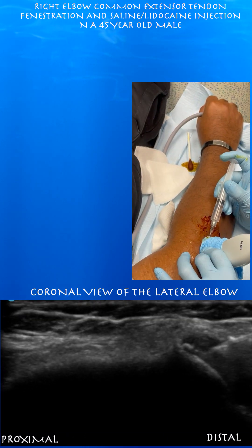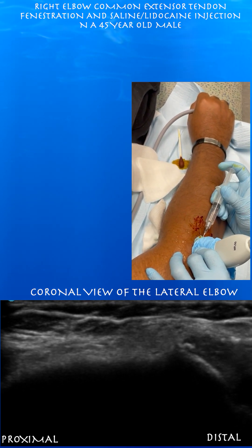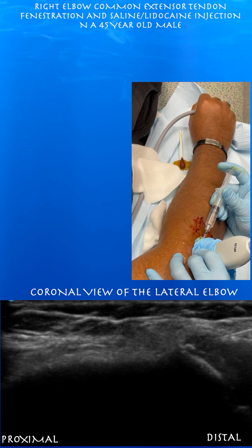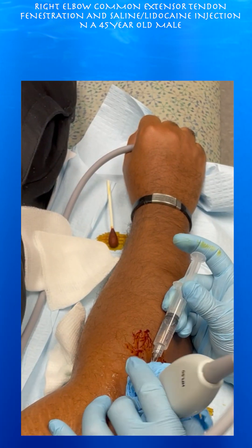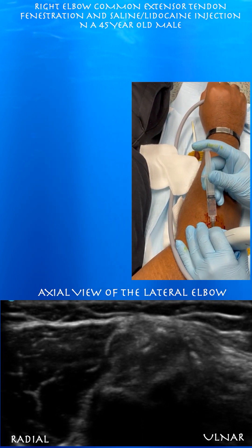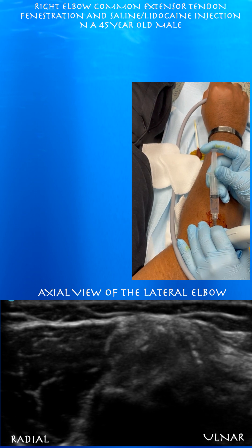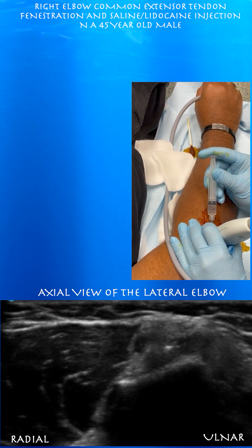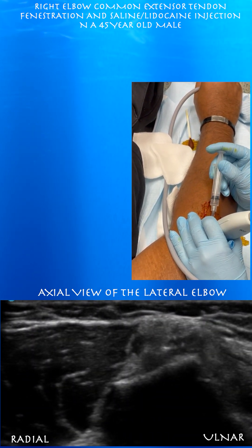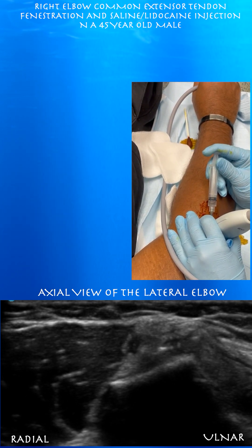Here you can see the needle on the right side of the screen. There's a school of thought that if you actually tickle the bone — the periosteum — it may elicit more of a healing response, so we're getting pretty close to the bone here. Doing a little axial view; you can appreciate the axial view here, which is good to orientate yourself from an anterior or posterior perspective to know exactly what part of the tendon you're fenestrating. You want to see that bright dot go in and out of view — that means you're essentially looking at the needle tip.